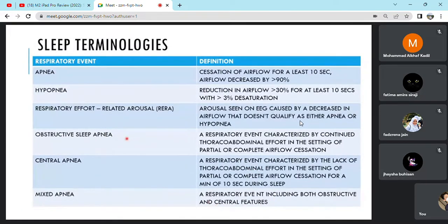Okay? For you to be able to understand this one better, no? Usually, we can actually have a very good illustration for this one, because in a patient suffering from obstructive sleep apnea, you will see, I don't know if you have seen somebody who has undergone polysomnography or your sleep study.